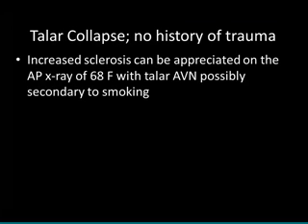What's the post-op protocol, such as cast, ROM, WB? For the removal of the bony impingement, I put them in a cast just to protect the arthroscopic wounds. That cast comes off in 2 weeks. I take out the stitches, put them in a removable boot, let them full weight bear, and they can return to activity as soon as they're comfortable.